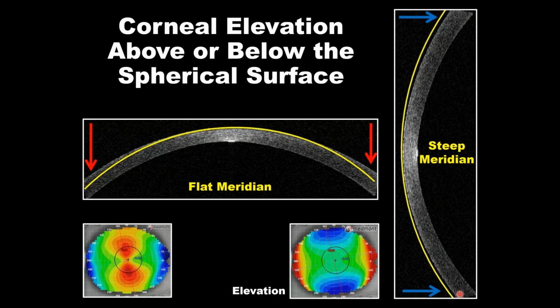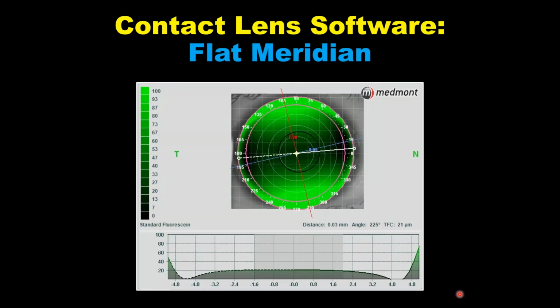If we want to understand anything about a fitting of any contact lens, a soft lens, a scleral lens, and everything in between, we need to understand height or sagittal depth. So if we take the same patient and place a rigid spherical corneal GP lens on eye, where do you think the contact lens will hit?